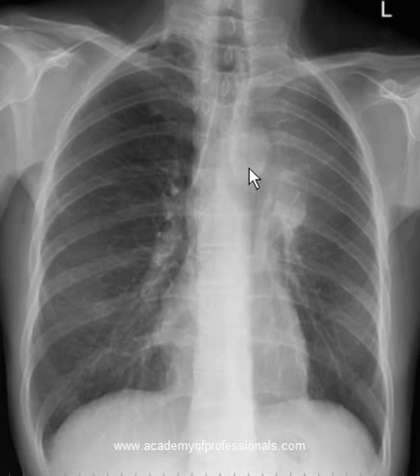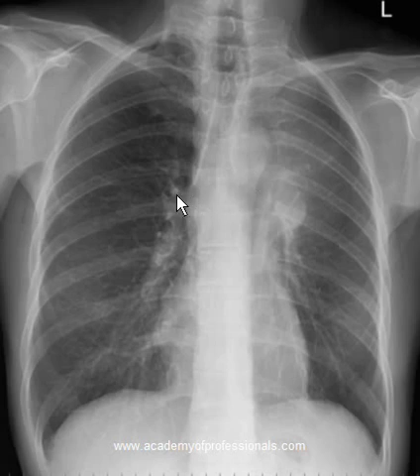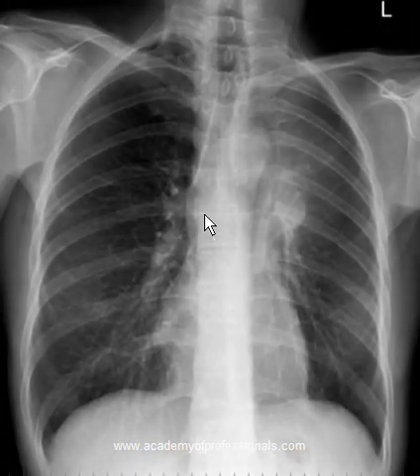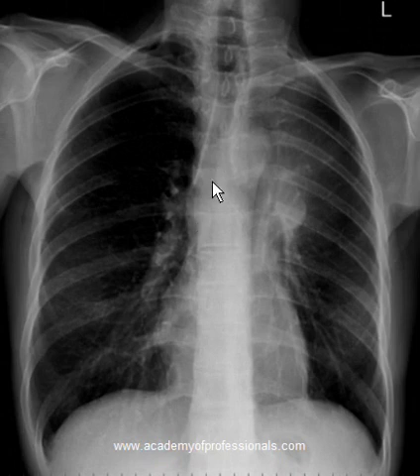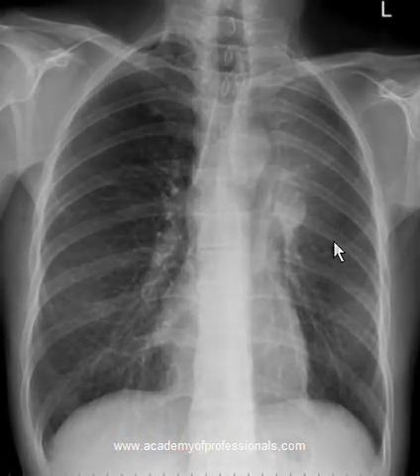The left hilum is slightly raised. Remember, the highest point in the left hilum is the left pulmonary artery, which is obviously not visible in this area. On the right side, the highest point in the right hilum is the right main bronchus. This is the right main bronchus, this is the left main bronchus, and this is the angle of carina here.